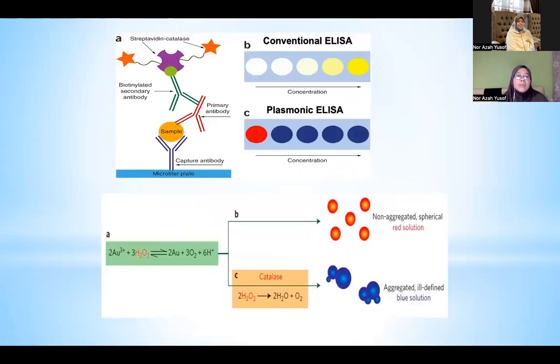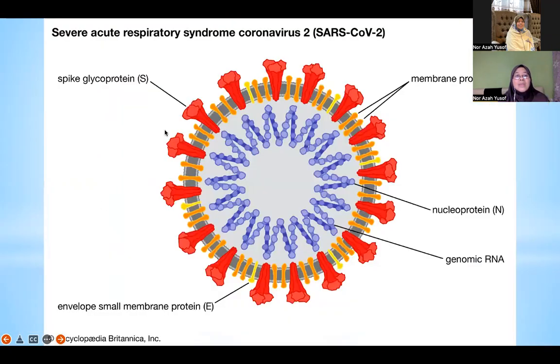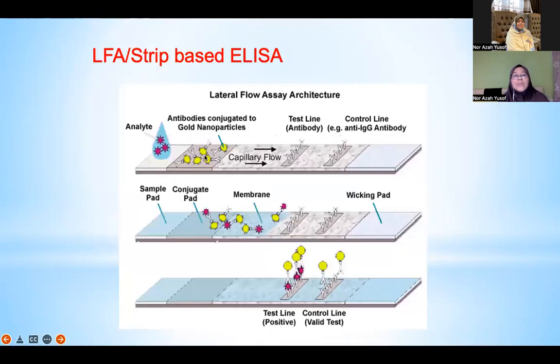So let me jump through. What are we using for the antigen test kit? This is what you see. This is your saliva that contains the virus. And this is the antibody. If we design the test kit based on the S protein, the Y-shaped antibody is specific towards this S protein. When we mix together, this is where you put the saliva, and you have to wait for the whole thing to move. So they start to move.